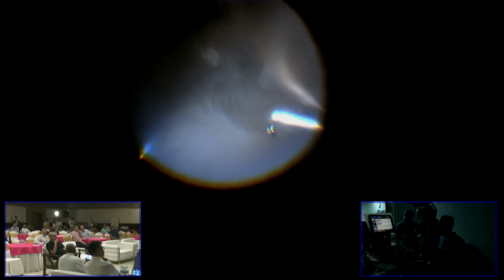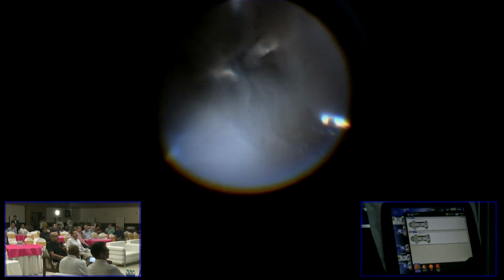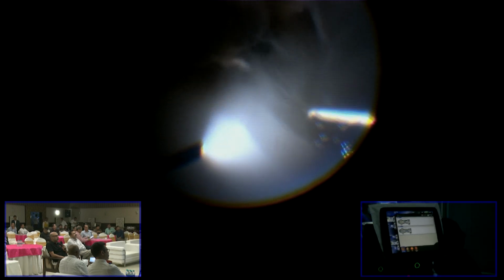So she is a phakic patient, and in such a dense vitreous hemorrhage we need to be very cautious, because sometimes RD can mimic blood stained posterior hyaloid. So we will use low suction and high cut rate, and keep away from the retina, and probably we will start our surgery in the nasal quadrant of the retina, so that even if the underlying retina is detached, we will be on the safer side. Am I audible clearly?